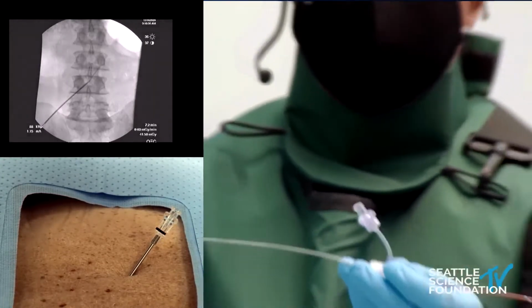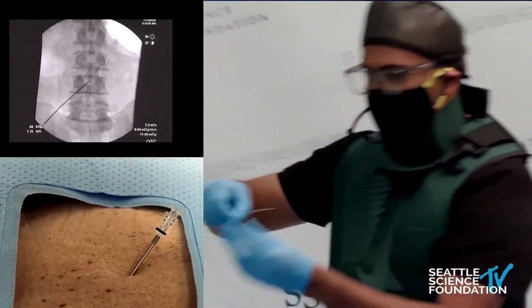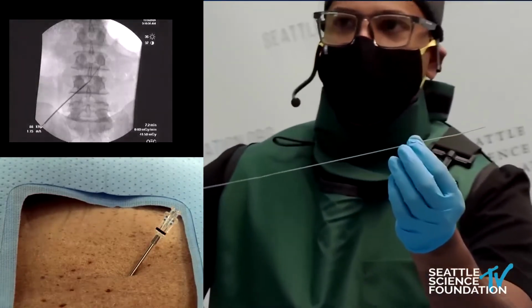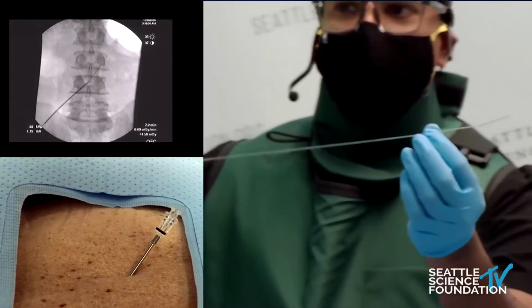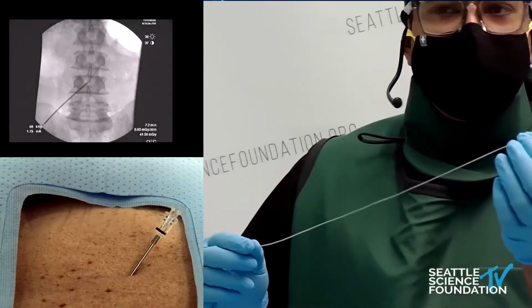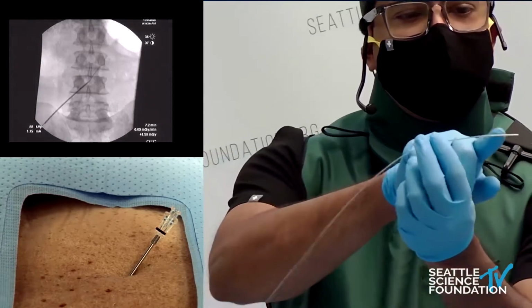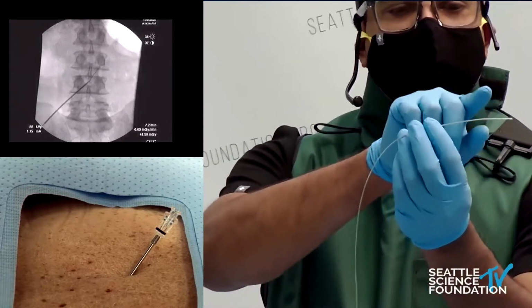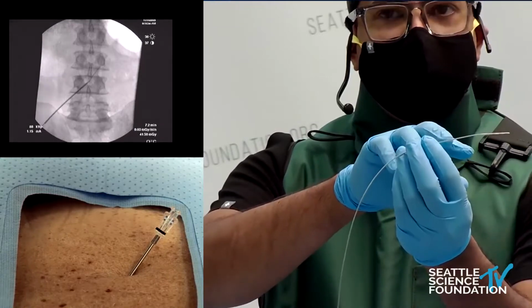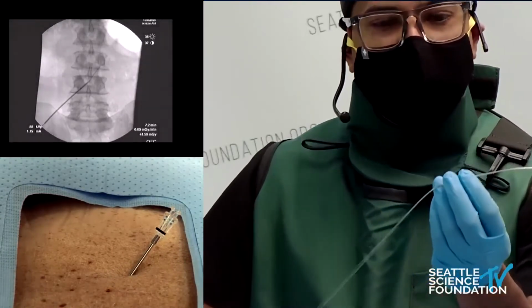And then you have the lead, and I'll just show you the lead itself. The diameter of this lead is 1 millimeter as compared to a dorsal column lead, which is 1.3 millimeters. As you can see, we have a quattrode system, so 4 contacts. We really only need to use 1 or 2 of those electrodes in order to stimulate. What we're trying to do is get electrodes 2 and 3 directly under the pedicle. And then in case there's any movement, you can always use 1 or 4, but really 2 and 3 we want to be doing most of the work as far as stimulation.